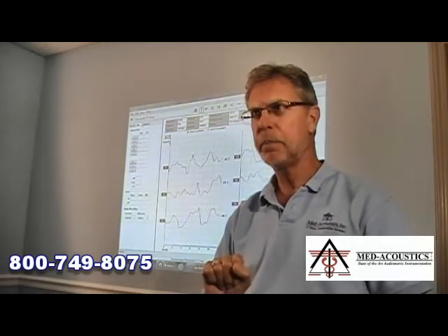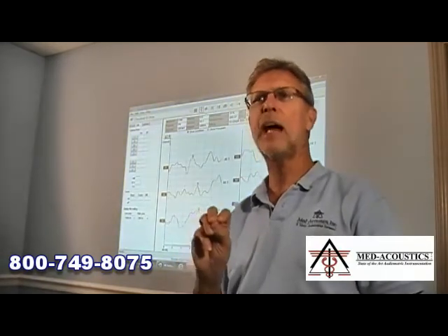Does it have a very poor signal-to-noise ratio, or does it have a very good signal-to-noise ratio? And this is done very quickly, say 40, 50 times per second, and they're instantly analyzed and given a score or a weight. And those that have a good score, in other words, a high signal-to-noise ratio, are given a high weight. So when they are calculated into the average, they contribute much more than the ones that have a poor score, a low signal-to-noise ratio. Those contribute to the average also, but they contribute less because they're not as good.